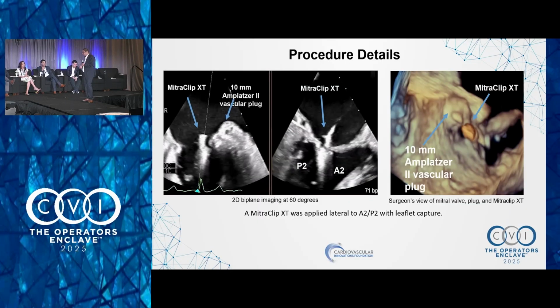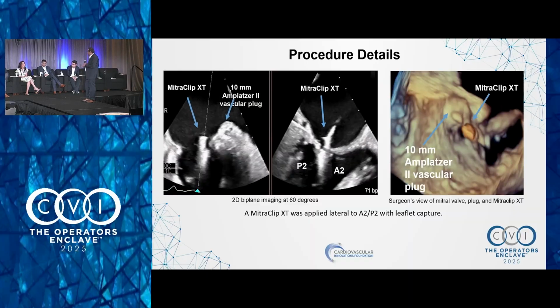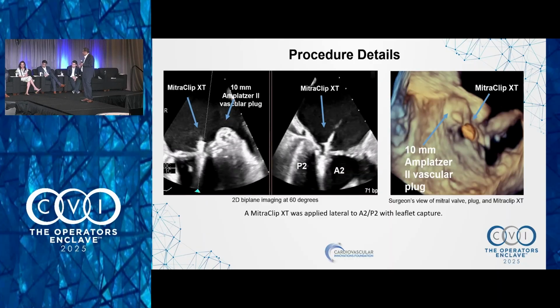Well, I think we went back and forth. I think you can go either way. I don't think anyone knows the correct answer. You can go first clip and then plug. It can go either way. I don't think there's any particular way.